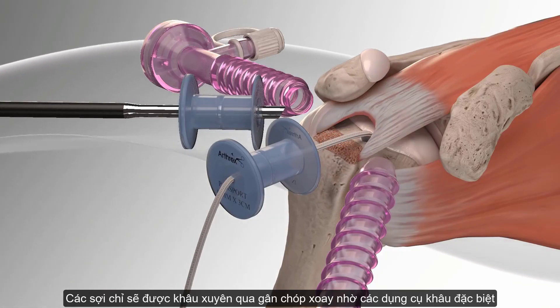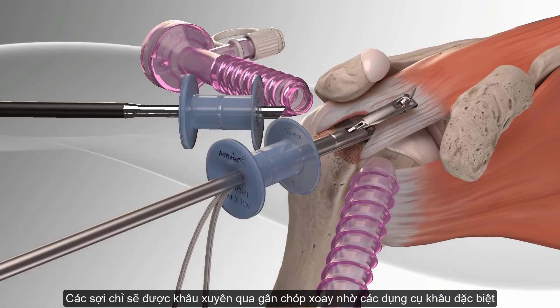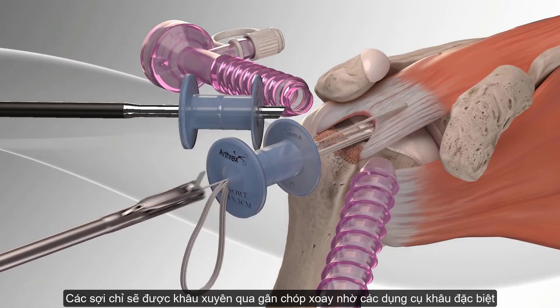The Fast Pass Scorpion is used to pass the fiber tape through the rotator cuff and retrieve it for use later.